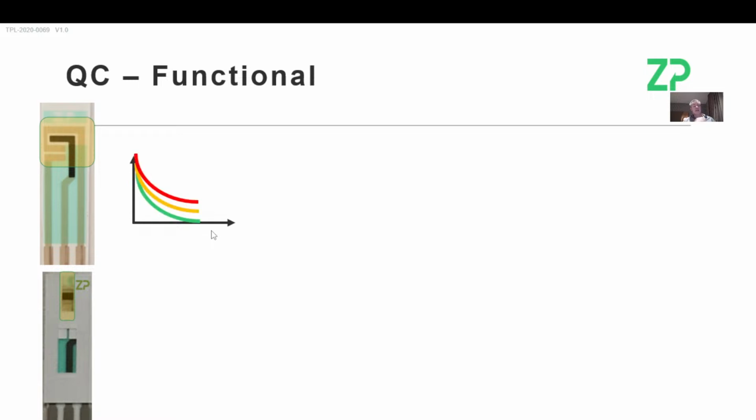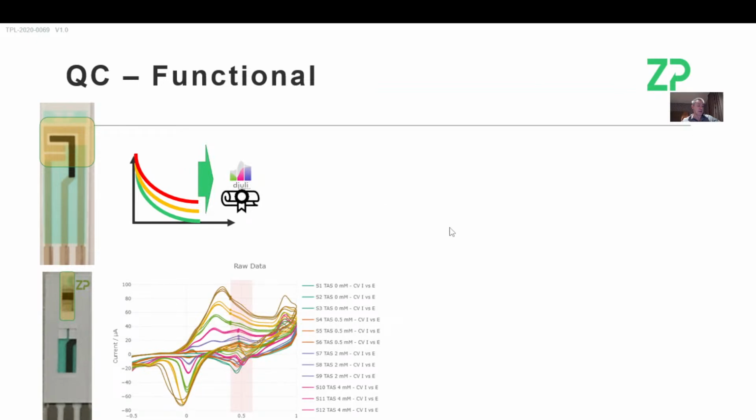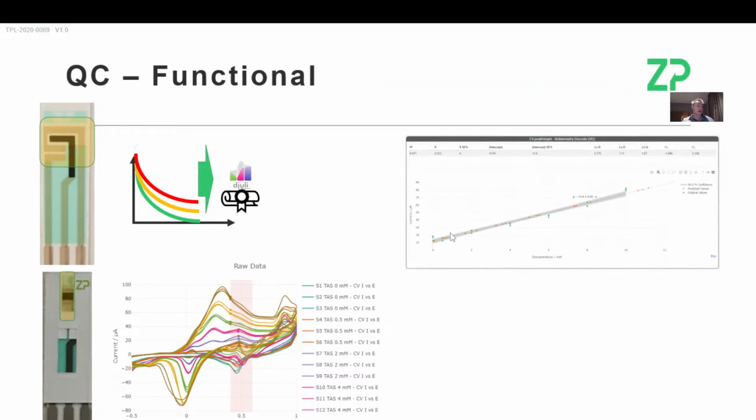This time we would actually test at sort of low, medium, high concentrations. What I'm describing actually gets us to the raw signal. Sometimes when people are doing testing, they're testing on a glucose meter, for example, and getting a glucose number. It's kind of useless because you don't see the raw signal, and so you can't troubleshoot readily. But the way we do it in the equipment we have, we can test at different concentrations.